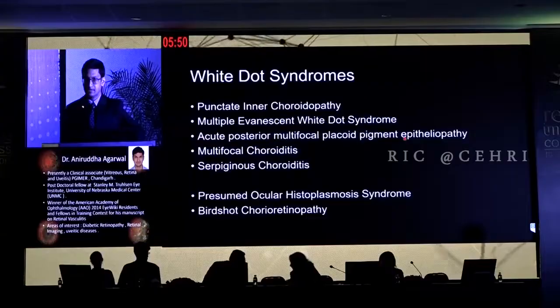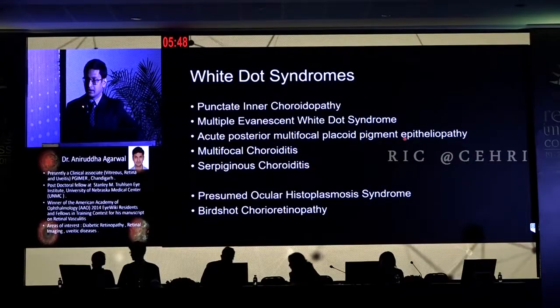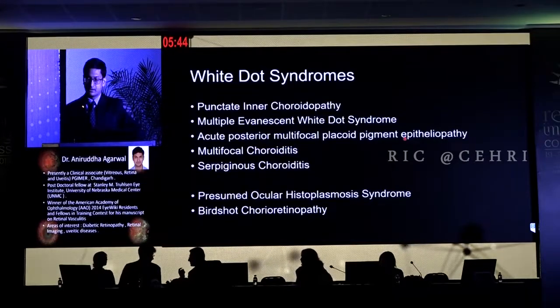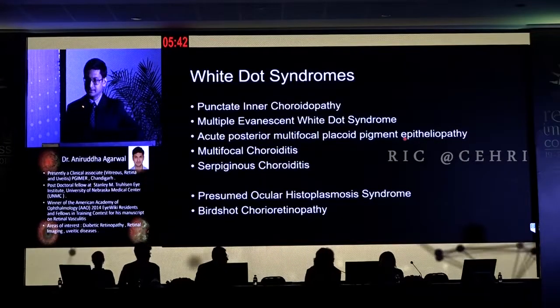It's been a pleasure. So I'm going to talk to you about OCT angiography in white dot syndromes. Now, with the increasing imaging modalities and the knowledge that we have gained over the past several years, we prefer nowadays no longer to use the term white dot syndromes, but rather call them by individual entities.